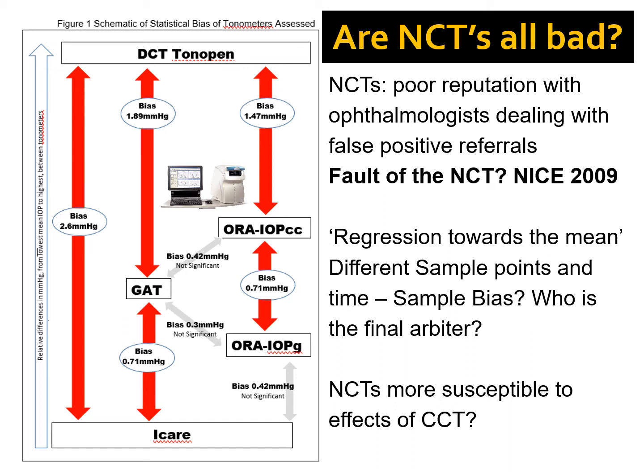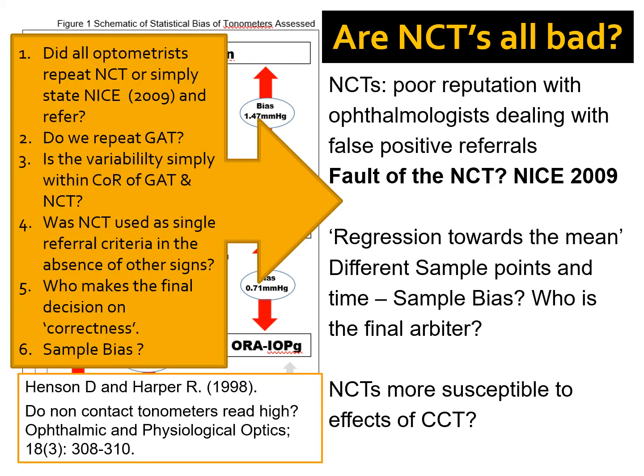Okay, that's one bit of evidence. You could get another one that doesn't. But why the bad rep, really? Could it be the fact that not all optometrists repeated the NCT, or simply that back in 2009, NICE said pressures over 21, refer?